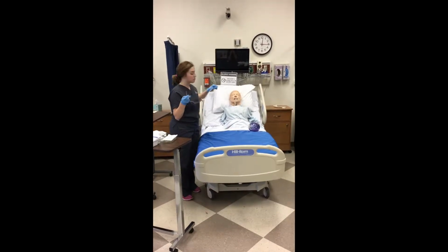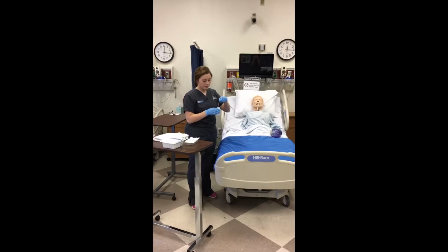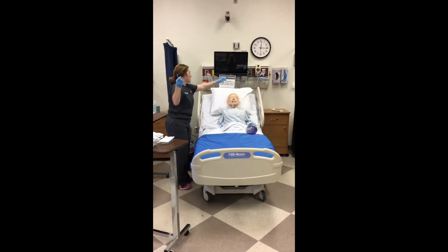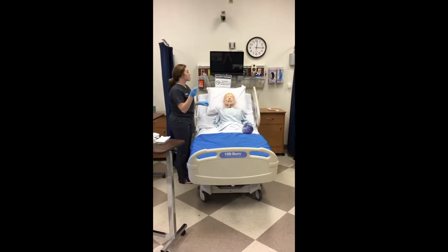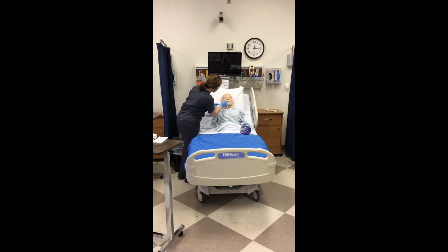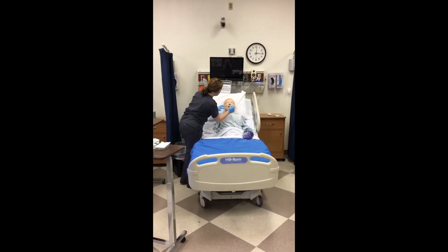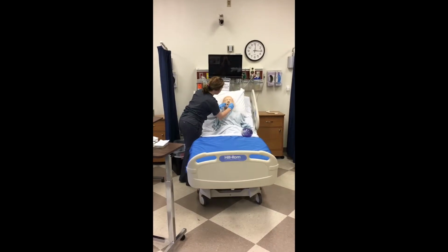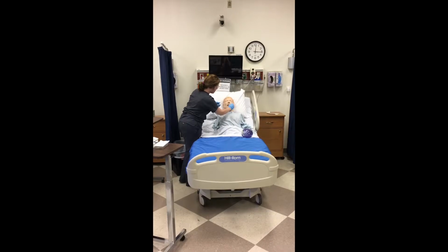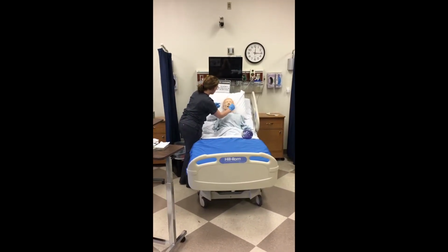You're going to attach this to your wall suction tubing. You're going to lubricate the tip. And now you're going to insert this into the mouth towards the oropharynx about 3 to 4 inches. And when you remove, you're going to want to suction intermittently. About 10 to 15 seconds is how long it should take to remove.